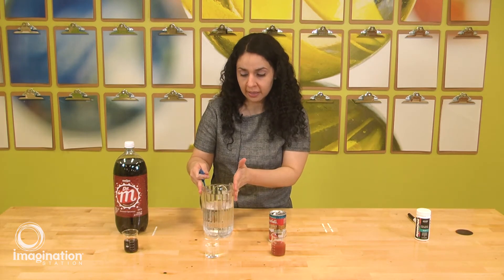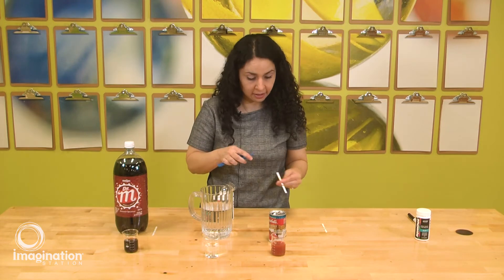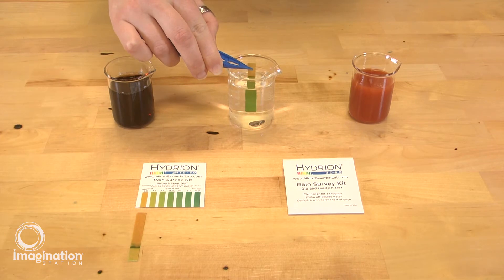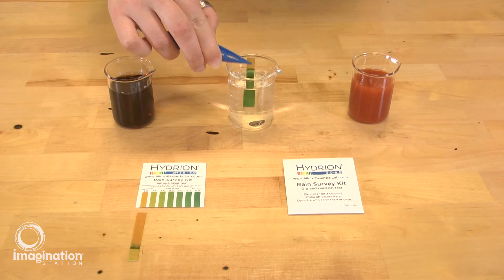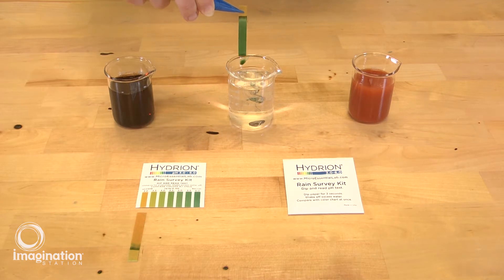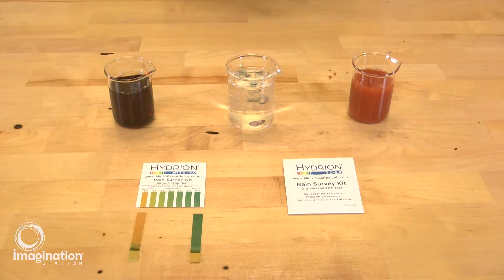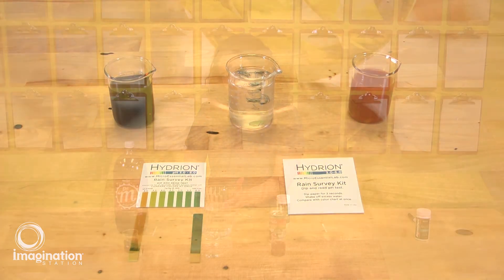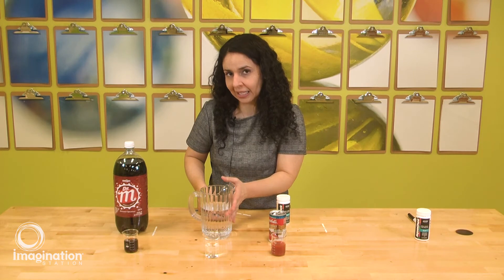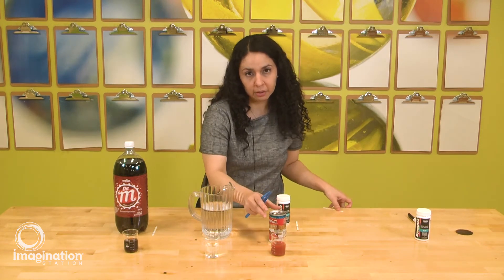Now we are going to move to the second solution — tap water. Again, we're going to take the strip, insert it very briefly, wait a couple of seconds, and then compare the color with our chart. Typically you will see that the pH for tap water is between 6.5 to 7, so slightly neutral.